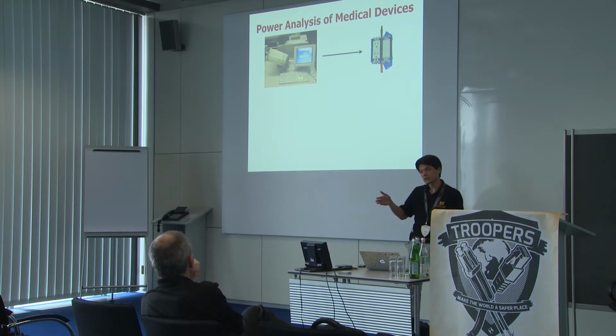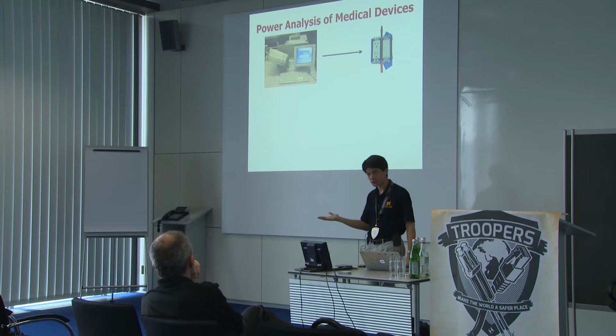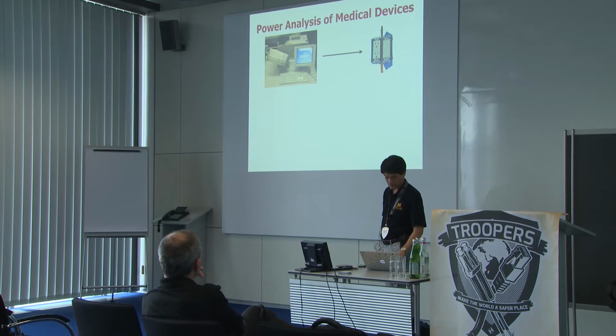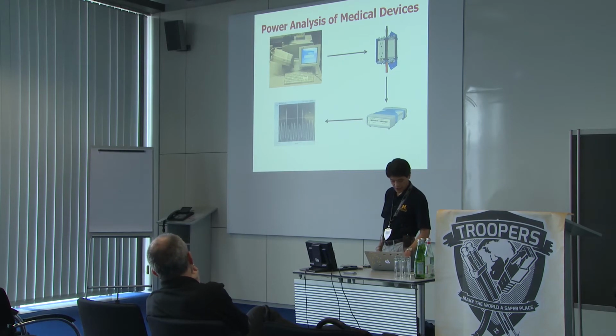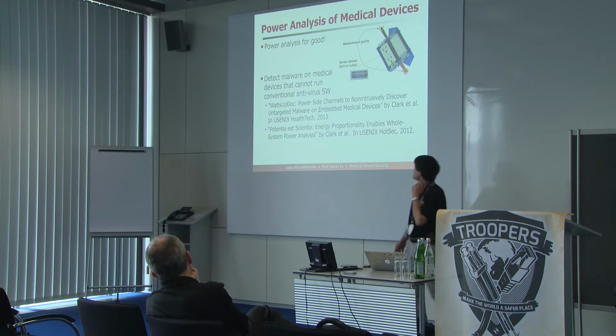And that changes not necessarily how much power is being consumed, but at what rate power is being consumed. So if you look in the frequency domain, if you do a Fourier transform on the power consumption, you'll begin to pick up subtle changes. It's not a signature of malware, but it's a behavior of abnormal things like malware. So we built a device that's basically a power outlet, does some machine learning, and from that you can actually detect the malware. This is an older version of it.